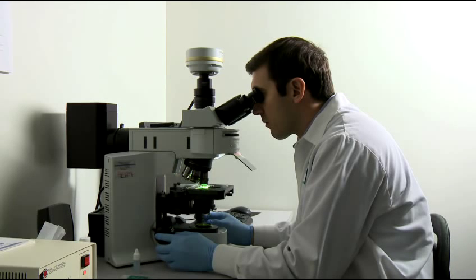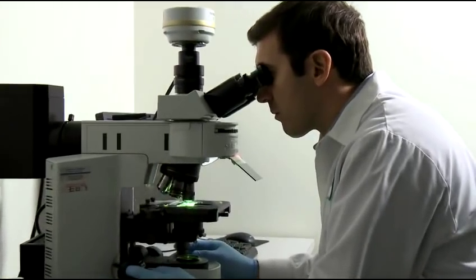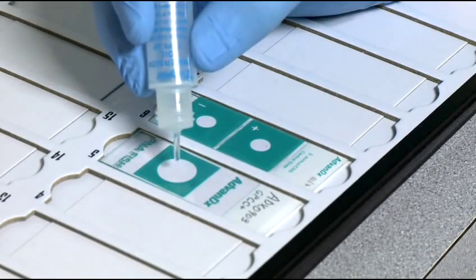The slides are now ready for examination. Add a drop of immersion oil to each cover slip.